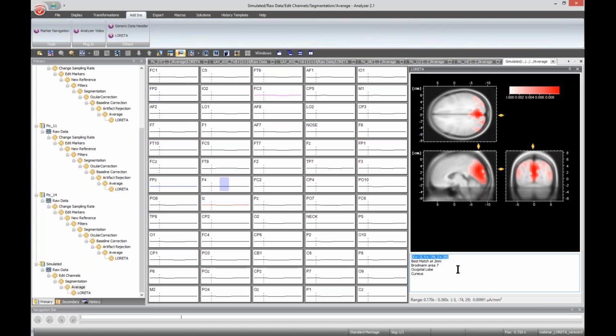I modeled it to be sitting at 1, and the algorithm provided me with 29. If you subtract 29 minus 1, you will get 28 millimeters. As I have already discussed, the size of a single voxel is 7 millimeters. So you can easily say that it is 4 voxels apart from the true source. In this way, you can infer the precision of the localization judgments.